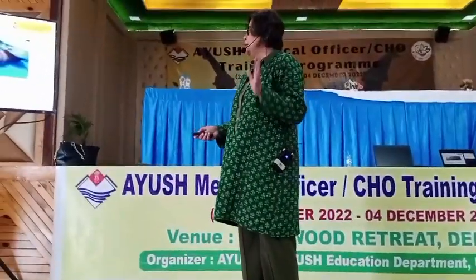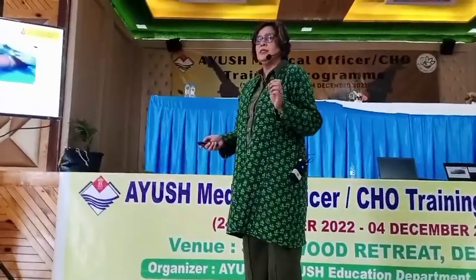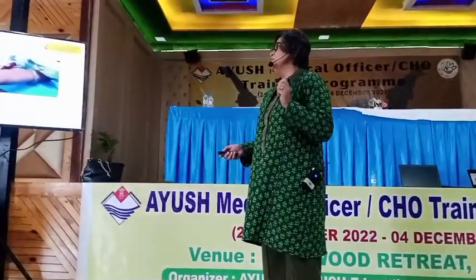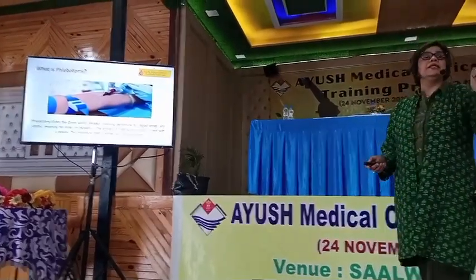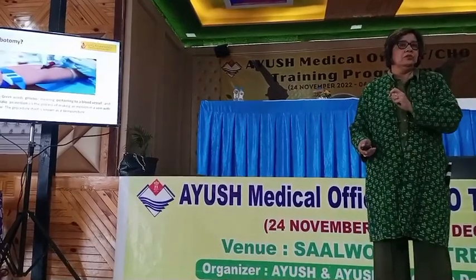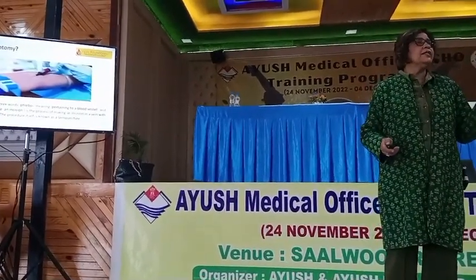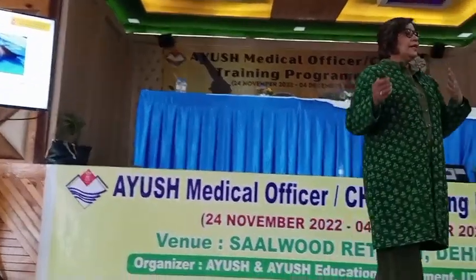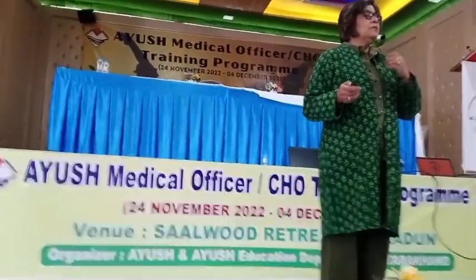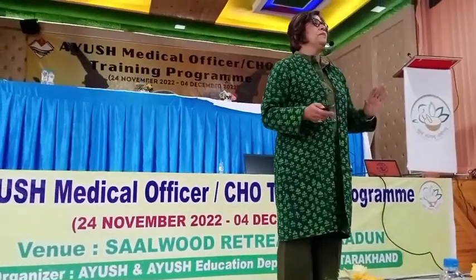What is phlebotomy? Phlebo is a Greek word, meaning blood vessel, and tomy means to make an incision. So it's the process of making an incision in a vein. इसको हम बोलते हैं veni puncture. You can also have an arterial puncture. जब ABG करना पड़ता है, that time you do the arterial puncture. But mostly it is the vein which we puncture.